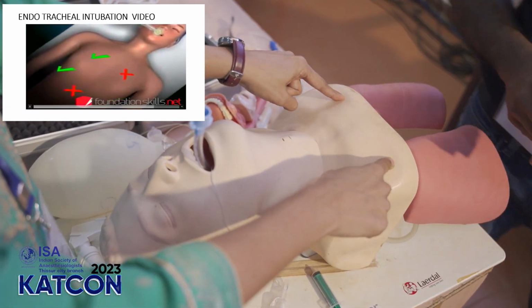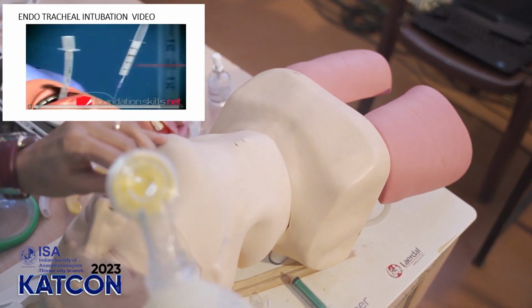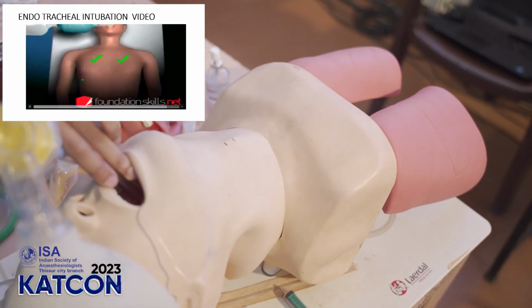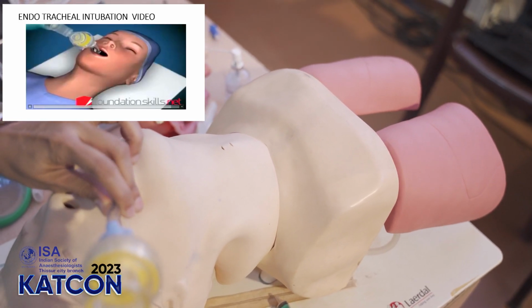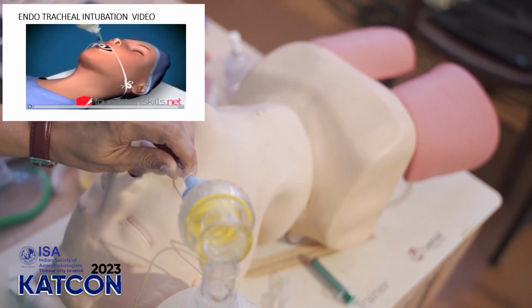If the tube is in too far, the right lung will be ventilated only via the right main bronchus. If you can't hear any sound on the left side of the patient, that means the tube has gone in more. If this occurs, deflate the cuff and withdraw the tube 2 to 3 centimeters. So we have to deflate the cuff, pull out the tube a little more, then reinflate the cuff and recheck the position. When it is confirmed, auscultate again. Once the tube is in the correct position, inflate the cuff again, tie it in place with cotton tape, attach the tube to the ventilating apparatus and ventilate the patient.